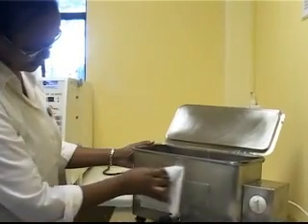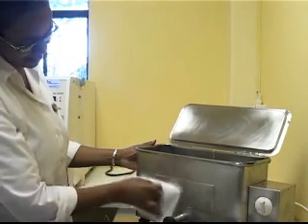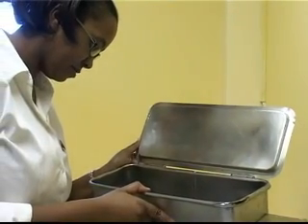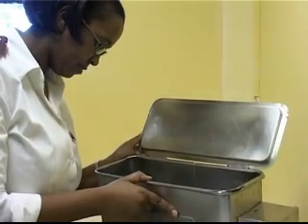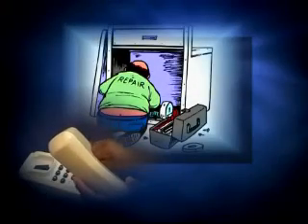Make sure that the instrument sterilizer is cleaned after each use. Wipe the outside with a cloth. Check the inside of the boiling pan for scaling and clean if necessary. Report any faults.